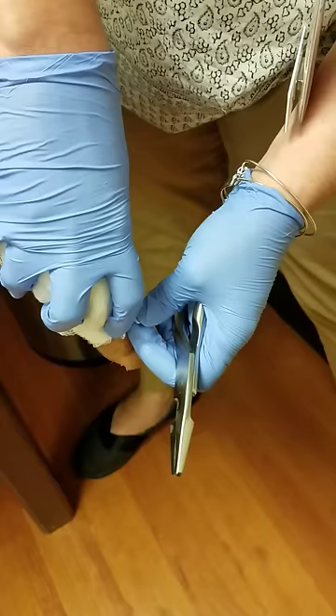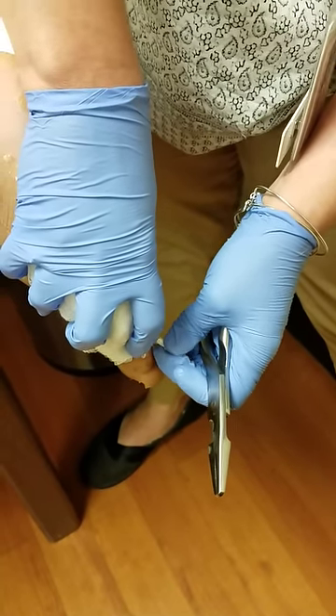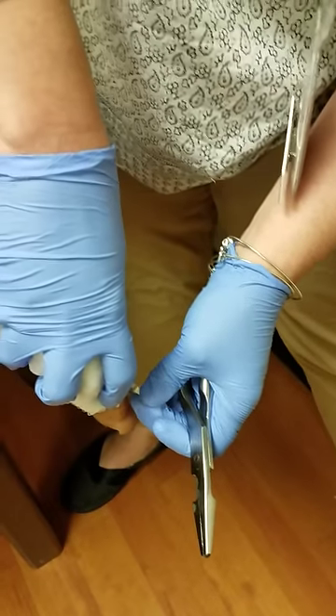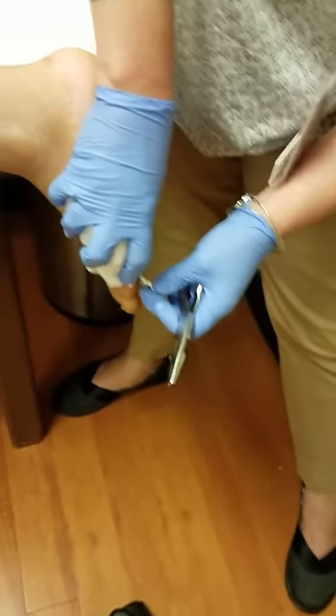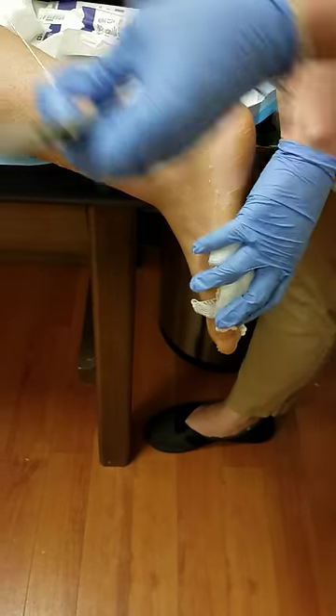Actually, it doesn't really hurt that bad. When she pulled the last piece out, it's because it had to break that skin. Now this one's just moving on its own, so bear with me here. That's going to be coming. I'm not even — I don't even have pliers. Look. It's gone.